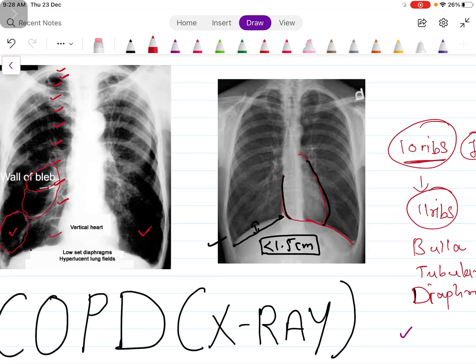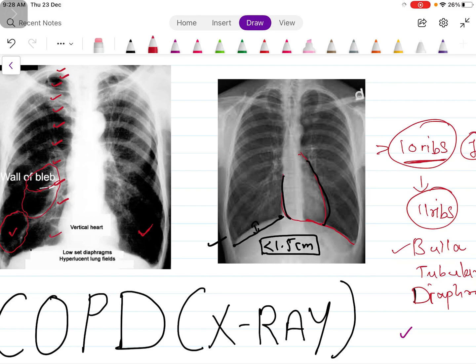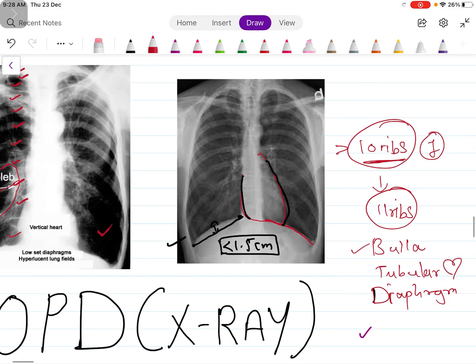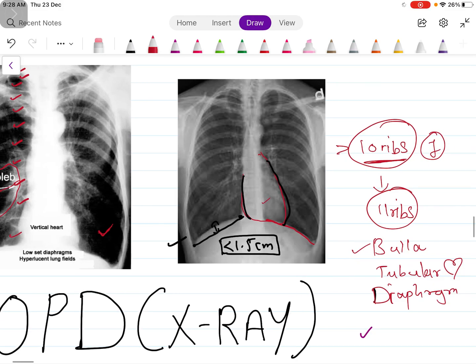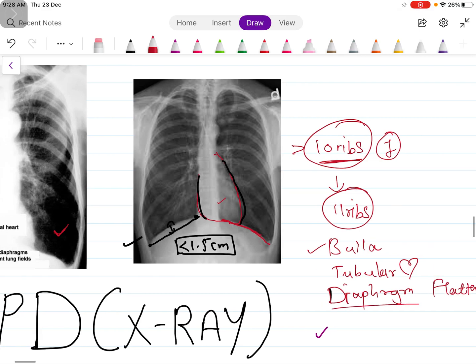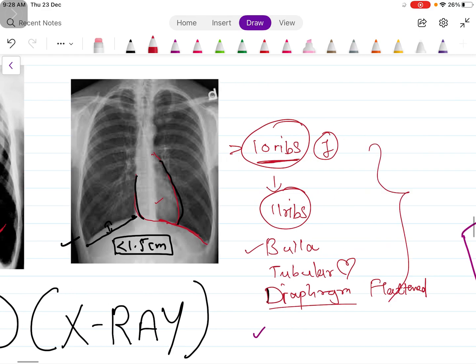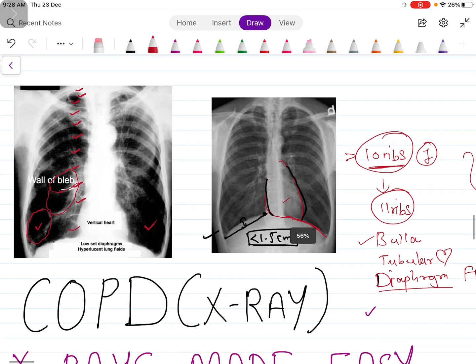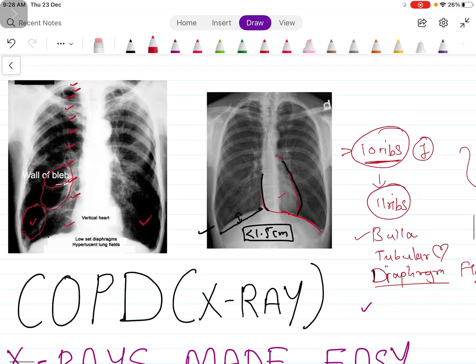So these are the findings. Again let me tell you: first count the ribs, more than 10 ribs means hyperinflation of the lung. Then you can see the bullae here. You can see these black lungs. Then you can see this tubular heart and the diaphragm pushed downwards. So these are the findings of COPD.